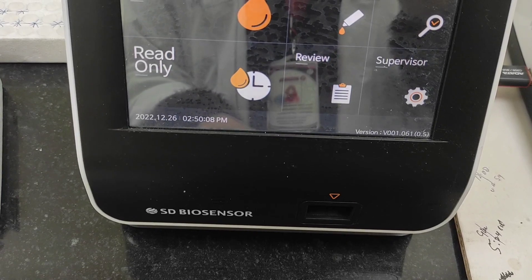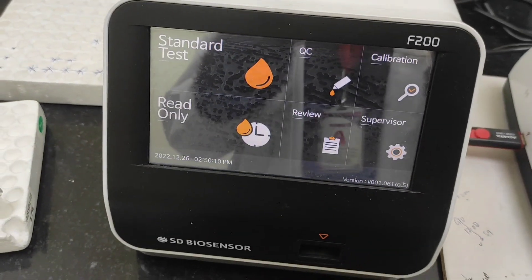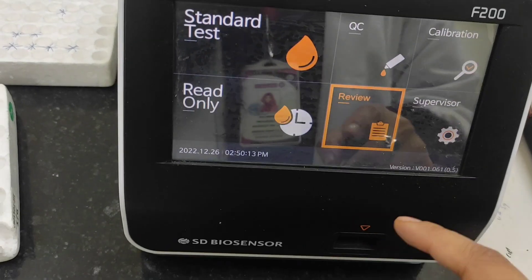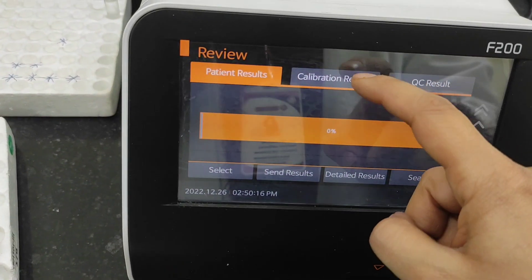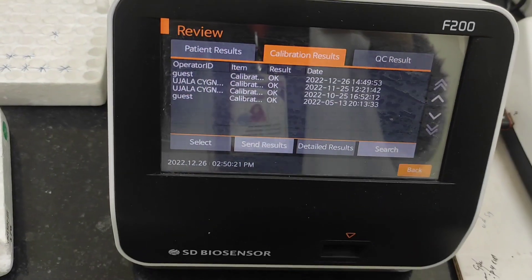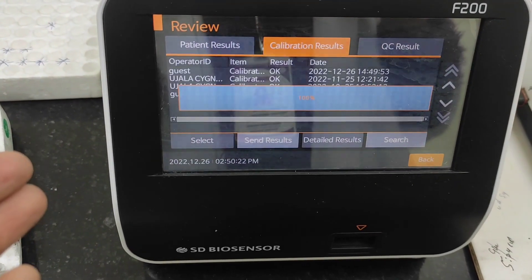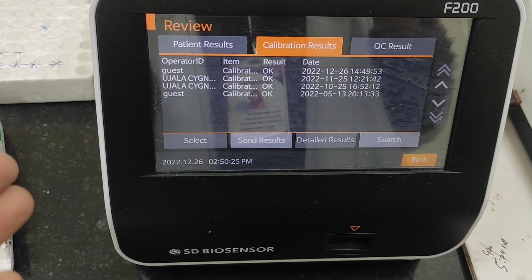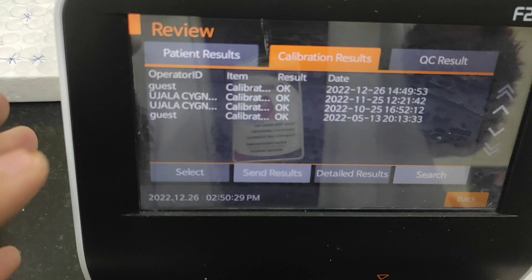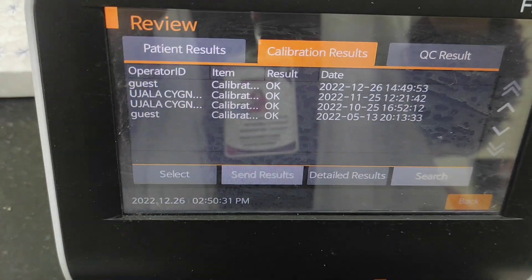If you want to check the results, go into Review and then into Calibration Results — here you can see the calibration results on the display. Everything is in the normal range and the calibration is done.